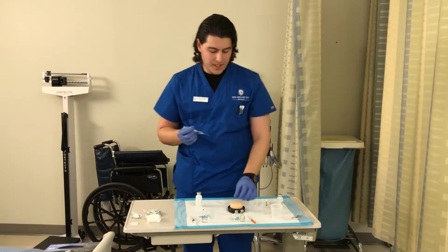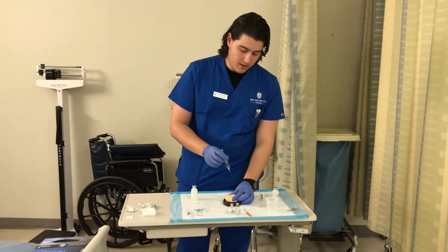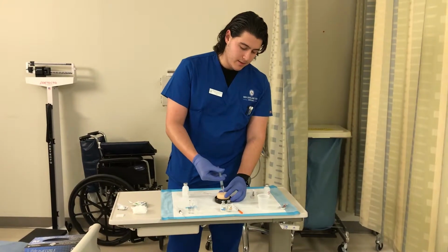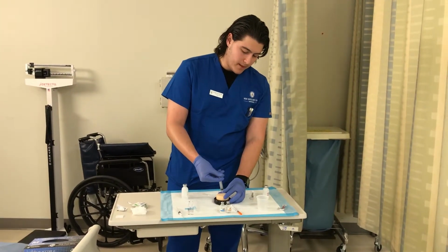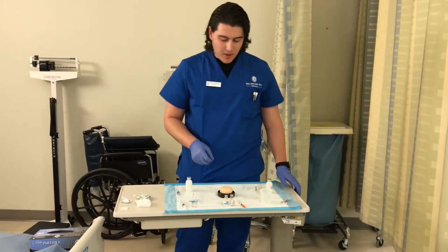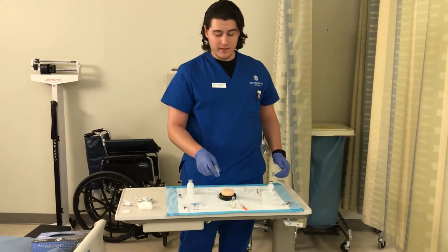Okay, there we go. This one, you're going to pinch the skin. It's going to go in at a 90-degree angle, approximately. Goes in, release, inject, and withdraw. The next one I'm going to talk about is the subcutaneous or insulin.